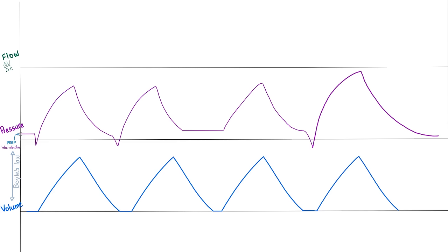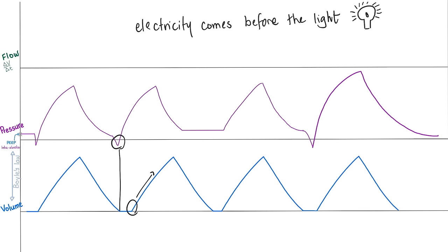On the ventilator waveform, here is volume and here is pressure. We set PEEP at five, so alveolar pressure does not fall below five — that's our baseline. The patient triggers the vent by creating negative pressure to suck air in; volume starts rushing into the lung, increasing lung pressure. Then air comes out and pressure decreases. Next cycle: negative pressure is created first, then volume rushes in — not the other way around. When the patient does not trigger and the machine starts by itself (e.g., comatose patient), the pressure deflection is positive, not negative.